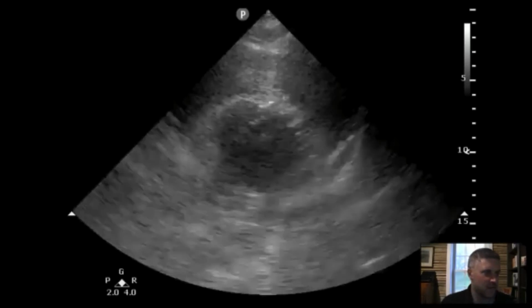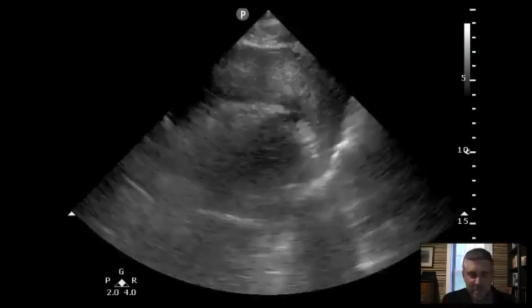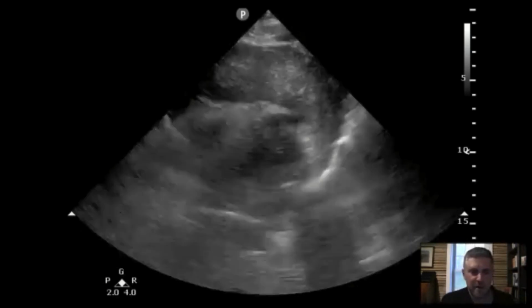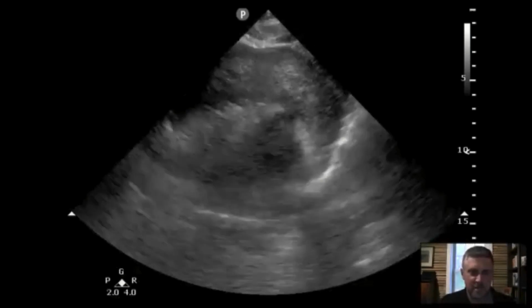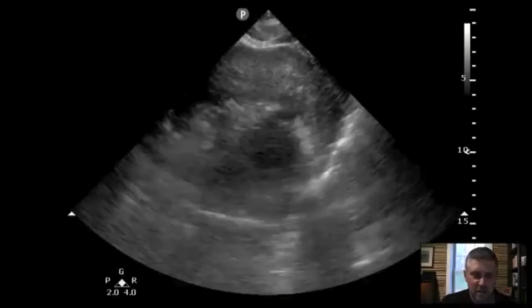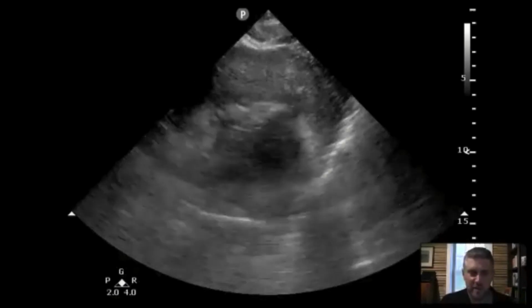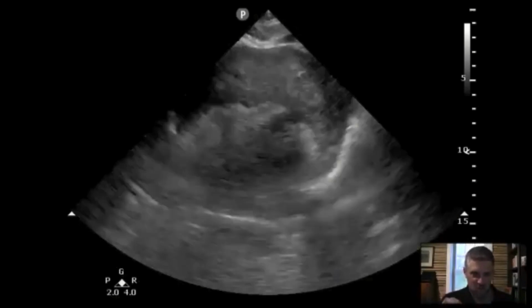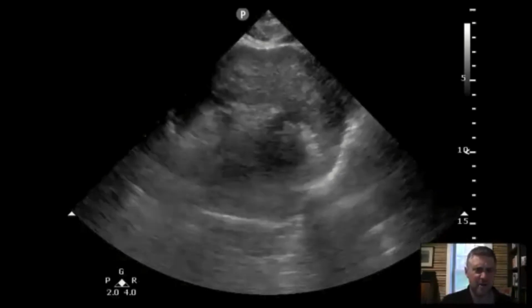Here is the ultrasound, right? So we see, this is basically a subcostal window. We see some movement, that's going to be the heart, but we see something inside the pericardial sac that's surrounding the heart. It's kind of echogenic, right? And so this is basically going to be a massive amount of hemopericardium with clot. You can almost see above that heart, that organized material looks almost like jello jiggling around inside that pericardial sac.